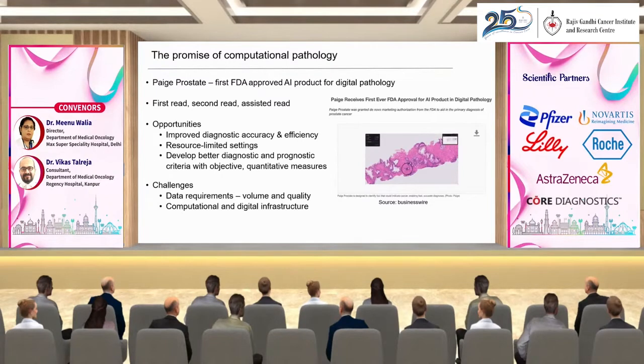Now coming to computational and digital infrastructure challenges. Computational challenges are that you require very good hardware to run this software and generate proper results. For digital infrastructure, bandwidth and other problems come in.